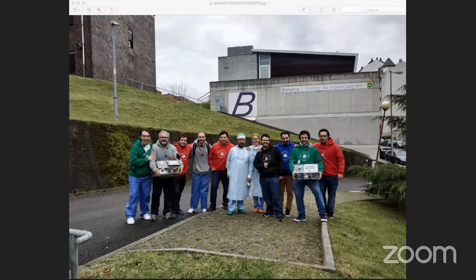Also, this security release valve for taking care of the lungs of the patient in case something goes wrong, and this PEEP valve. So I don't want to extend on that part.